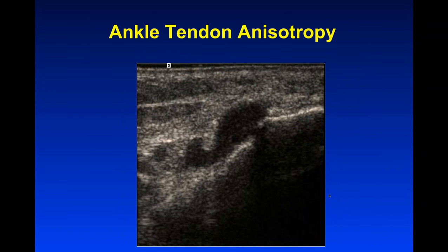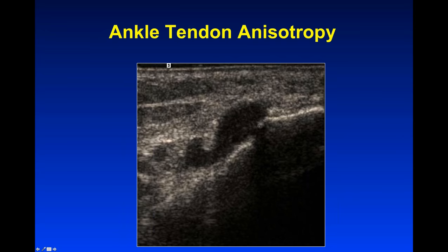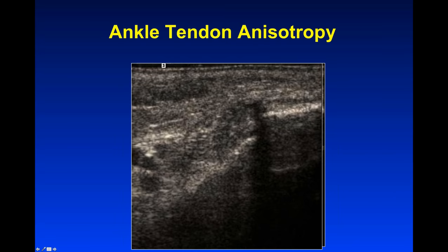It's also important to realize that anisotropy can occur on transverse images. This is an example of a transverse view at the medial ankle — our sonography students may encounter something that looks like this and get confused during a DVT study. When we rock the probe, however, we can see these dark areas fill in with the typical brush pattern. What we're seeing is an anisotropic posterior tibial tendon and flexor digitorum longus tendon, easily corrected by tilting the probe. This is not a DVT.